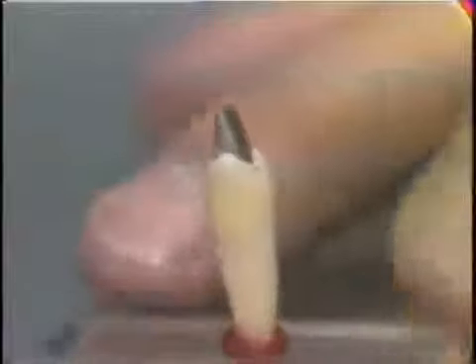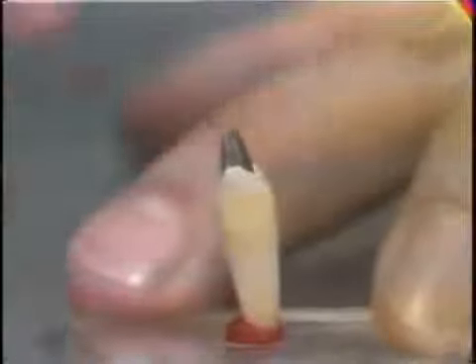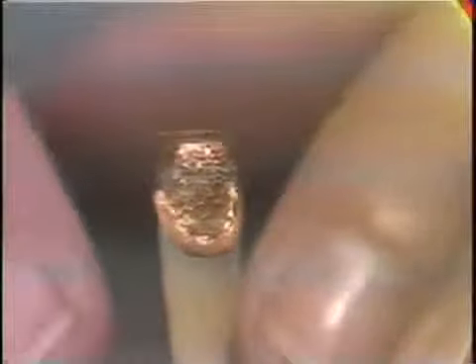The gold fabrication which is made for this, you see here, a proximal view, coming around now to a labial view. Here is the window with the bead retention in it for acrylic resin in this particular case. When we use acrylic resin, we give incisal protection to it, so you can see the incisal layer of gold going across there. Notice the preparation follows the contour of the soft tissues.